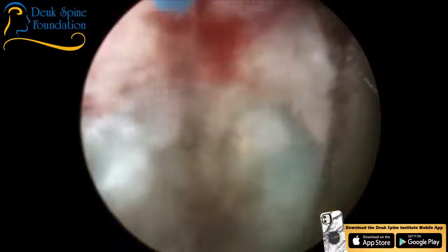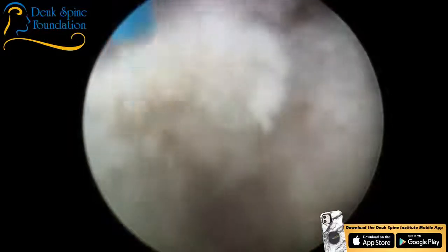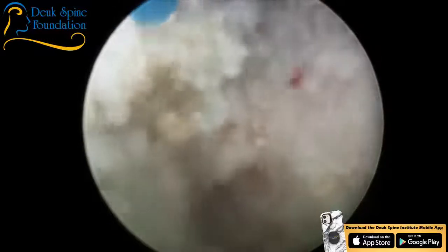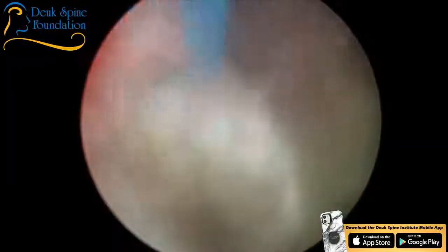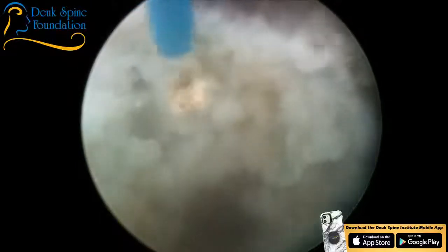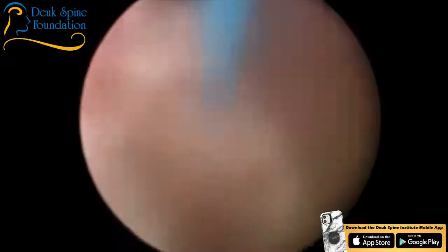So that looks pretty good. That looks good. The back here looks pretty good. I'll just zap a little bit over here and we'll be done with this level. Once again, this is L5-S1. And what you're seeing over there at 3 o'clock, that little blood coming out, that's the end plate of, let's see, that's going to be the end plate of the sacrum over there. And the L5 end plate will be just up here. And I think we're done here.